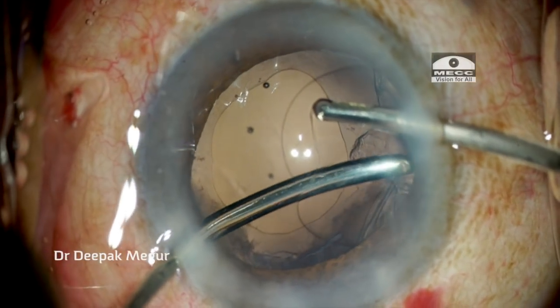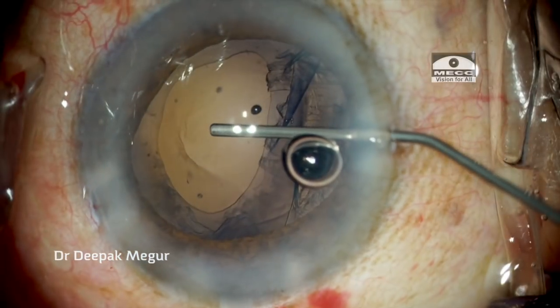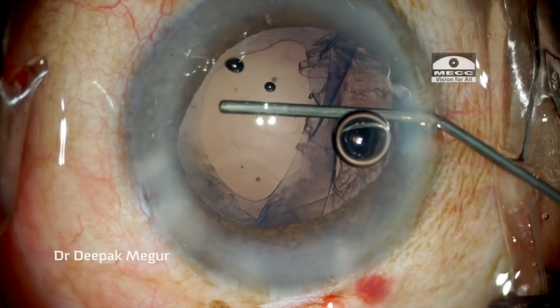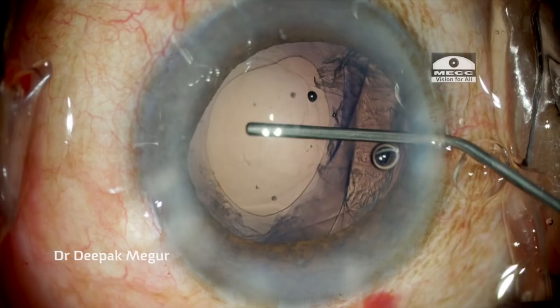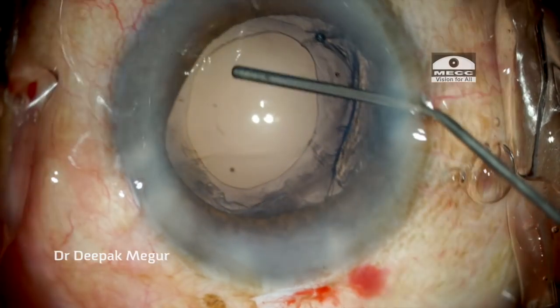The rhexis margin has become D-shaped and we can see that there is an area of zonular weakness, which is exemplified during cortex aspiration. So I am forming the bag, making the bag deep by injecting OVD. I prefer to use sodium hyaluronate in these situations.